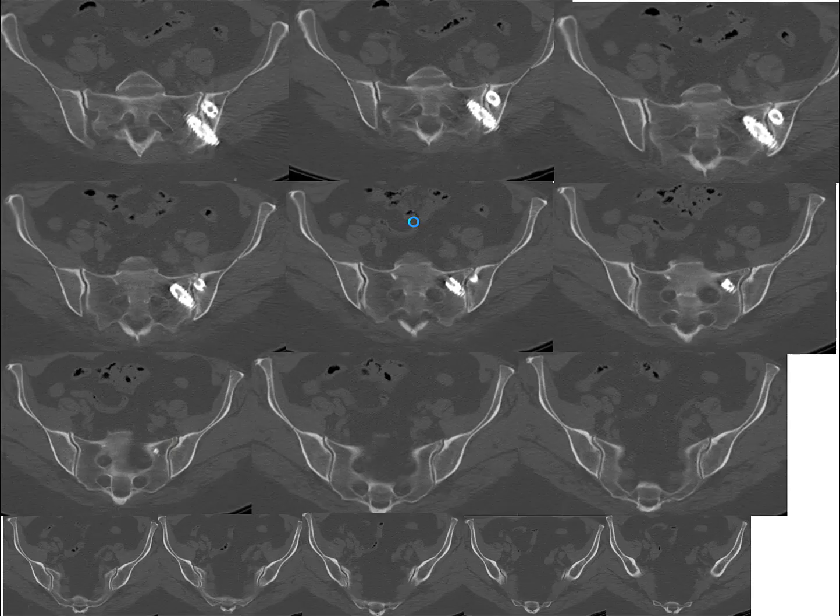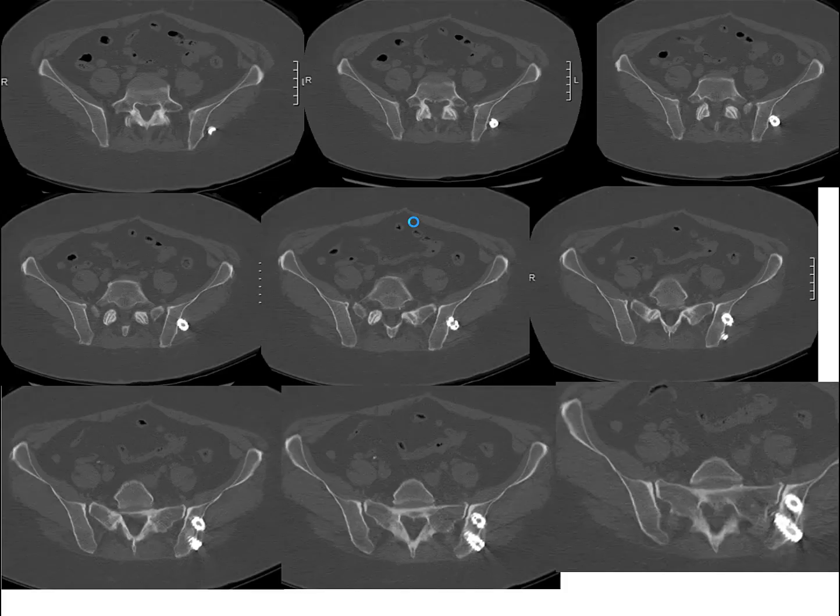Hold on, so is this helpful? Yes, so I operate in kind of two areas. Here, I would go in posteriorly, pop the cap off the posterior iliac crest and go down into that wide posterior iliac. I'm talking about maybe the upper row here. Here? Yeah, or come down, the middle one. So I would go right there and take that posterior iliac crest out and then bone graft.